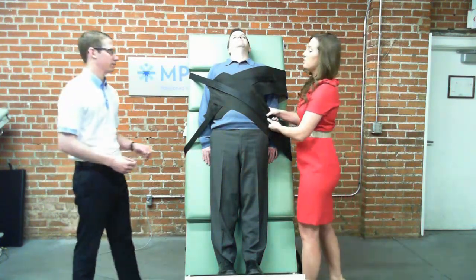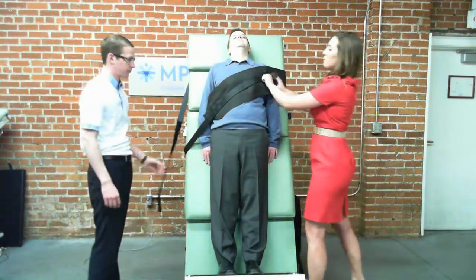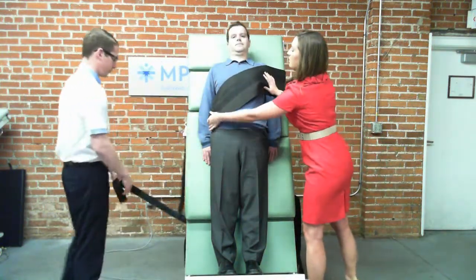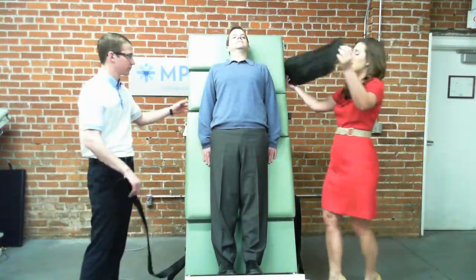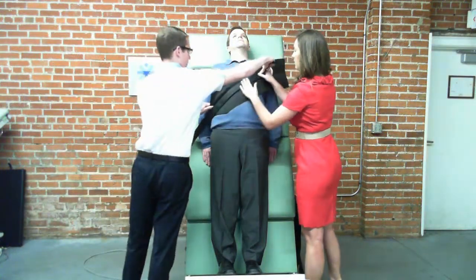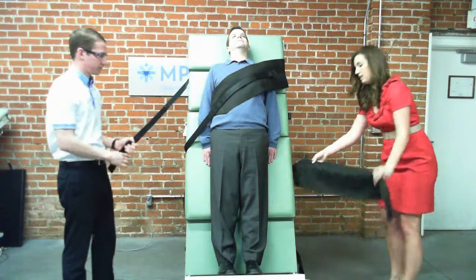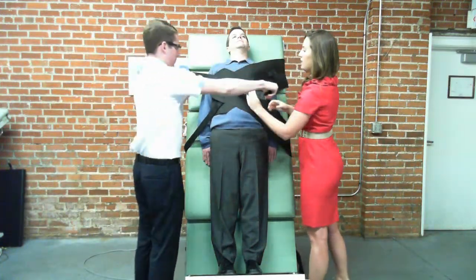So just to demonstrate this real quick, pretty simple process. Start with the larger of the straps, pick it up and cross it down, and then take your other strap and do the same.